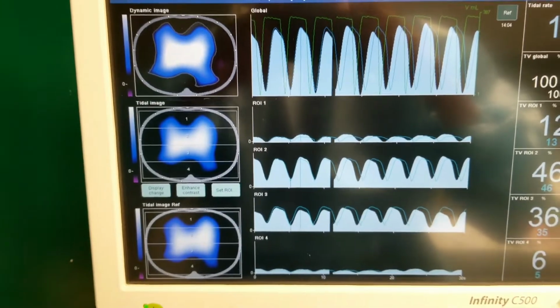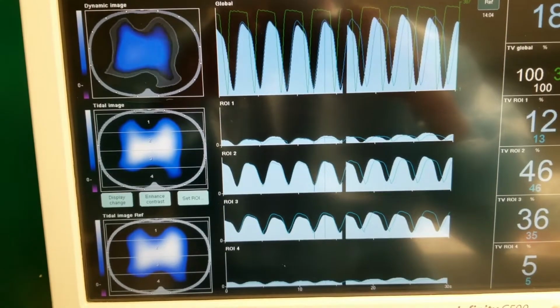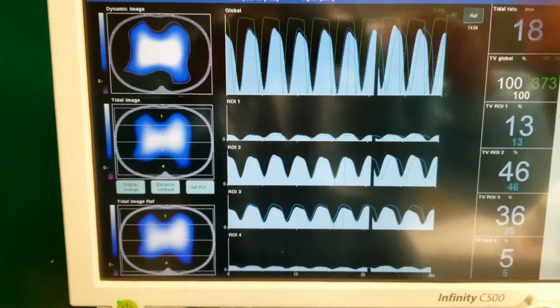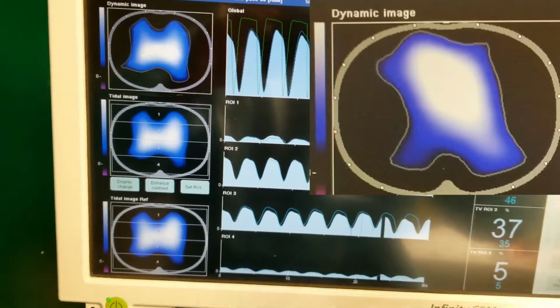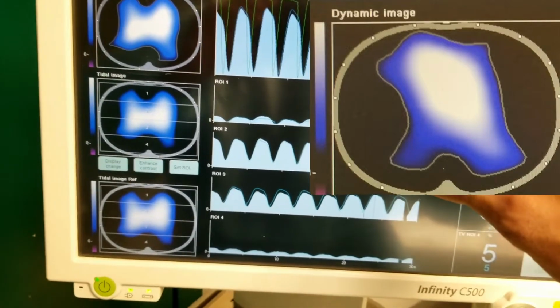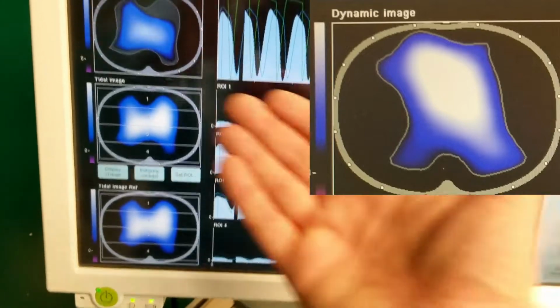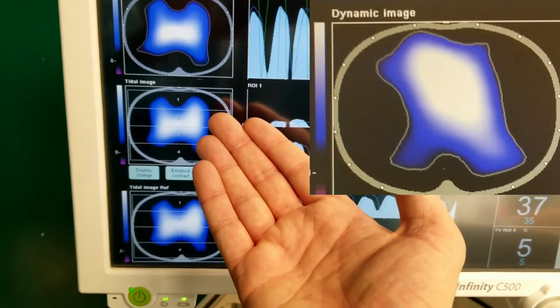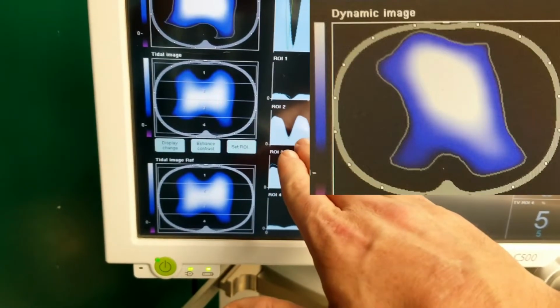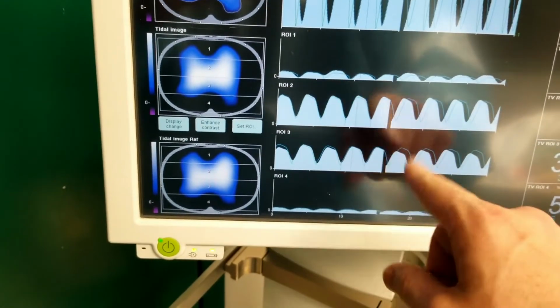All right, so this is the next day. Since the patient was hovering on 75% oxygen, it seemed like there was a normal distribution of ventilation. I'll pop up the other image where you see that it's well distributed, but the white intensity tends to be around the ventral areas a little bit more. So we're flipping the patient, and we're hoping, since there was good ventral distribution initially, that when we put the patient in a prone position on their stomach, there might be a better ventilation of perfusion.